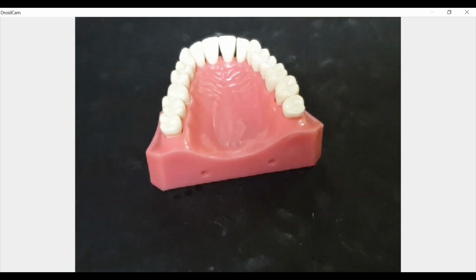Now what happens is when you're working with centrals, the length of the tooth itself gives you a lot of frictional retention. So you don't really have to use clamps. You can even work without clamps. You can use wedgets to complete your isolation.